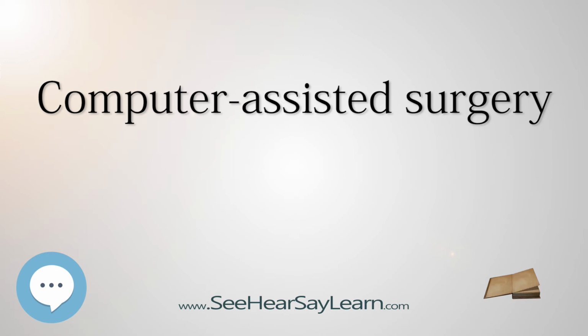In a further step, abutments are covered by gold cone caps, which represent the secondary crowns. Where necessary, the transition of the gold cone caps to the mucosa can be isolated with rubber dam rings. The new prosthesis corresponds to a conventional total prosthesis, but the base contains cavities so that the secondary crowns can be incorporated. The prosthesis is checked at the terminal position and corrected if needed. The cavities are filled with a self-curing cement and the prosthesis is placed in the terminal position.